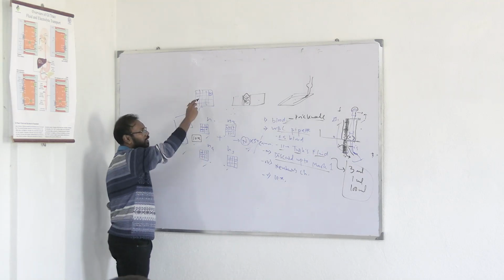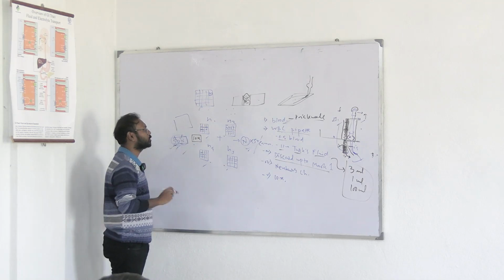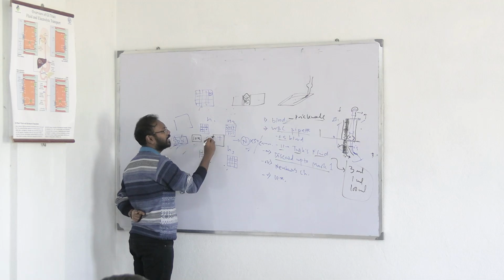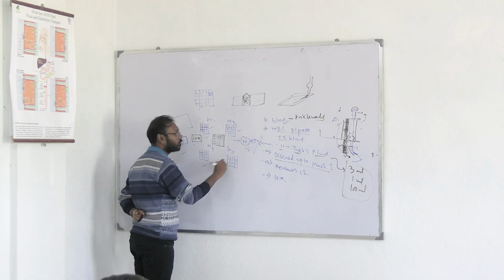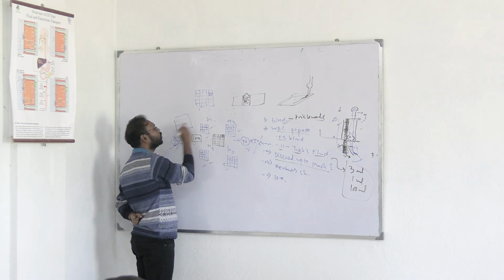Another difference between RBC and WBC, I have already explained well last day, but today just to recapitulate, how will you understand this? The RBC chamber is present in the middle. This is 5 into 5. So the first difference is 5 into 5. WBC chambers are 4 into 4. Next, every RBC chamber again is divided into 4 into 4 also.